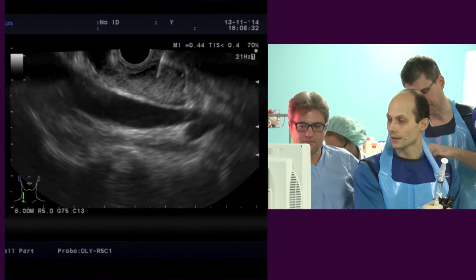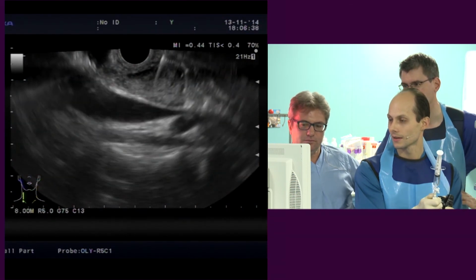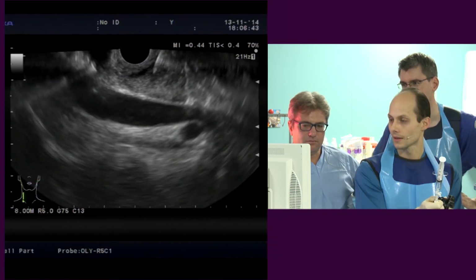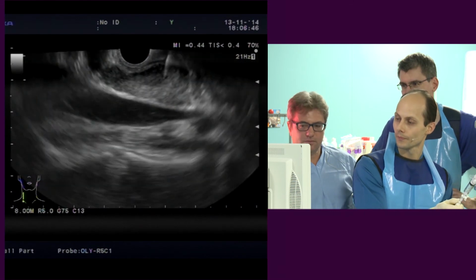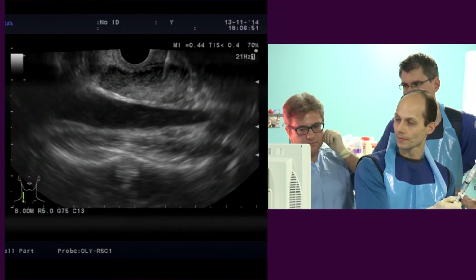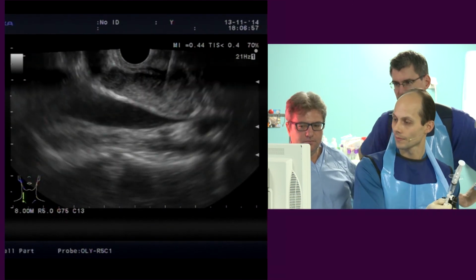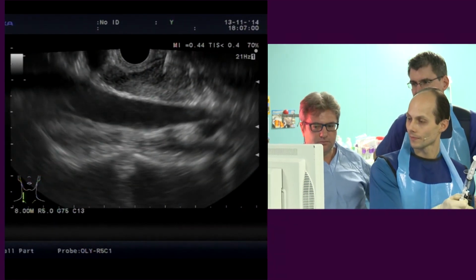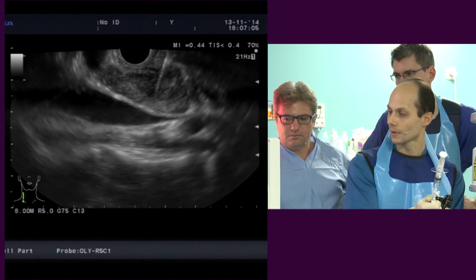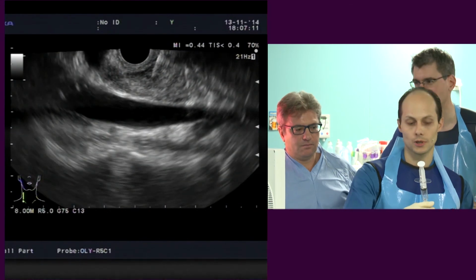A small comment: if lymph nodes respond to a chronic process for a very long period of time, and one of the components of inflammation is the immune component, then lymphadenopathy could be associated with considerable collagenization and even calcification. That's why we see this alteration, not because of inflammatory cells, but because of secondary changes with enlarged stroma in the node. It could be hyperechoic, dense, and calcified, and might even look like a tumor.